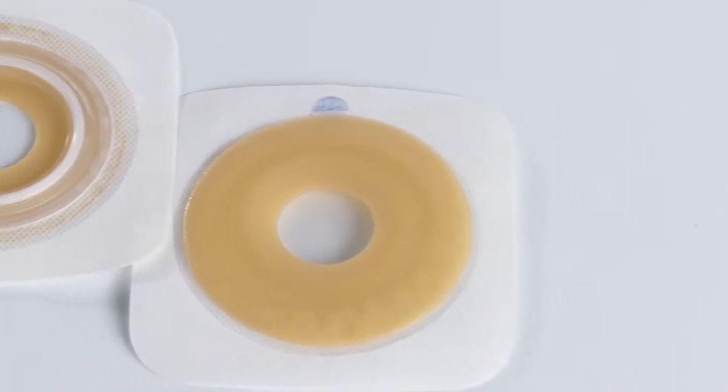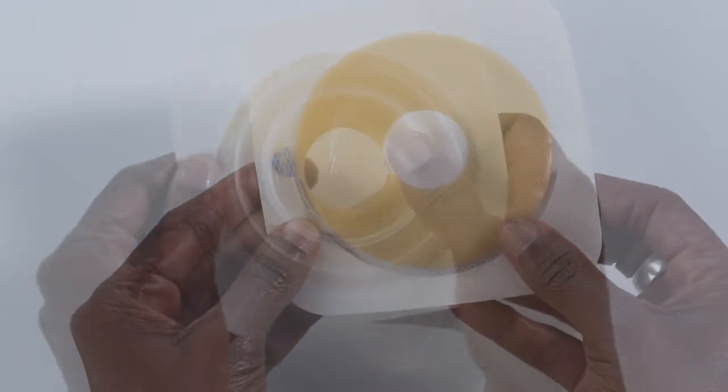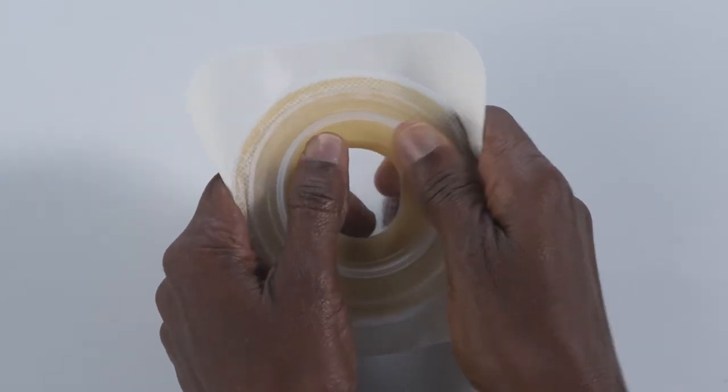To apply, start by removing the barrier from its package, but do not remove the clear release liner or release paper. Press your thumbs or fingers at the center of the starter hole and begin to roll and mold the hole to the size of your stoma.